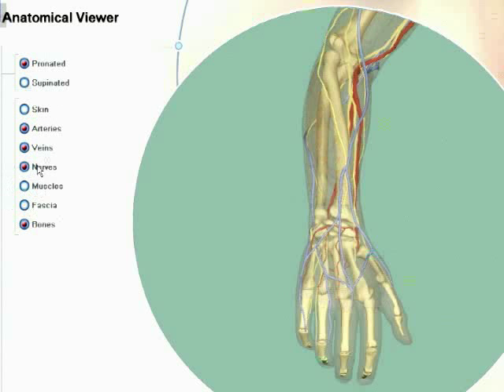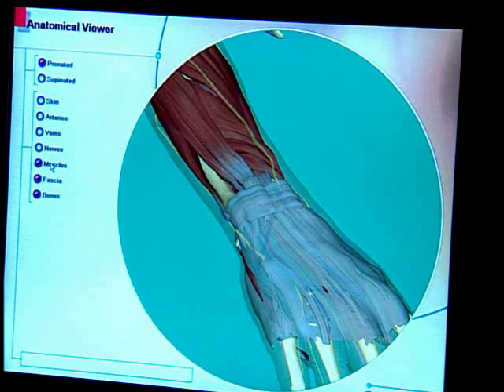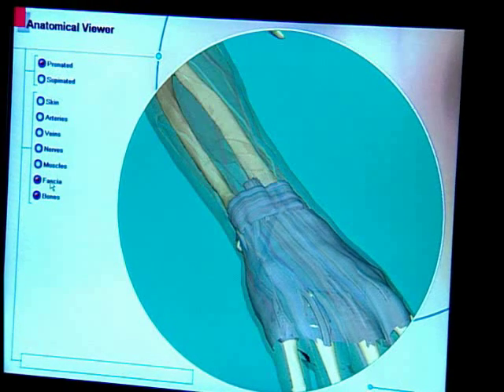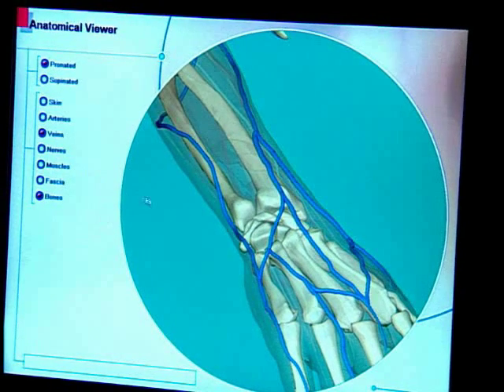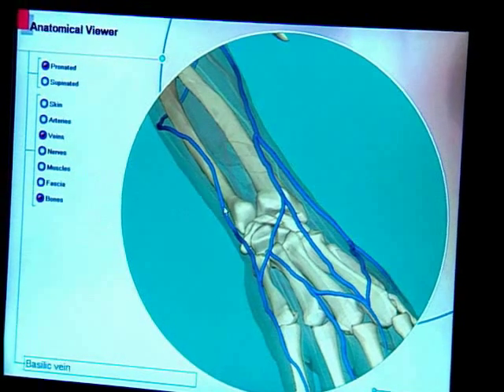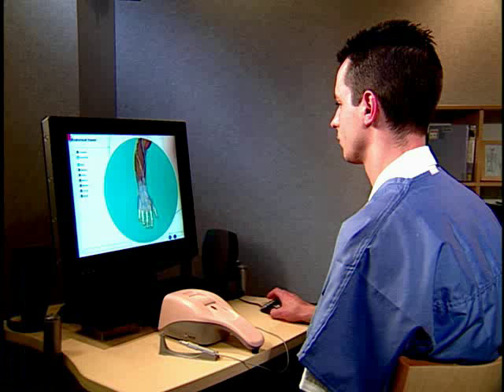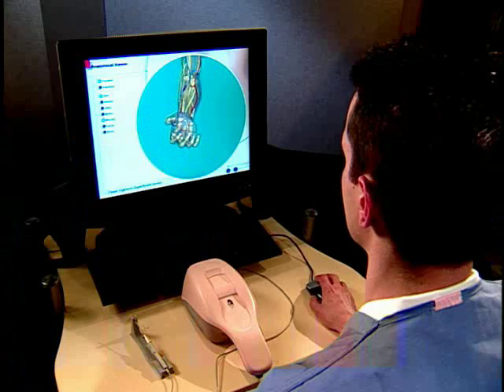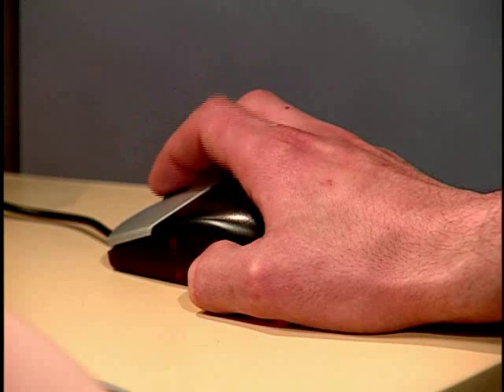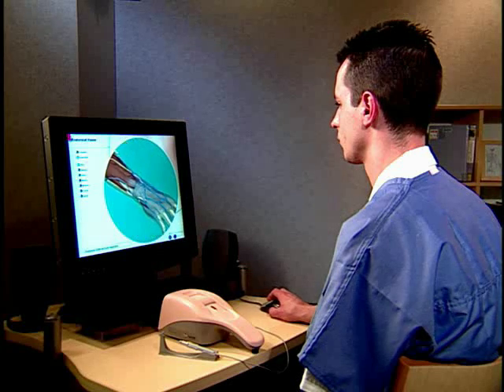You can dissect the anatomical structures by clicking on the button corresponding to the structure. Deselecting a structure causes it to fade, while selecting a structure causes it to reappear. This function allows you to focus on only the structures you desire to view. To zoom in and out of the arm, scroll the middle mouse button.